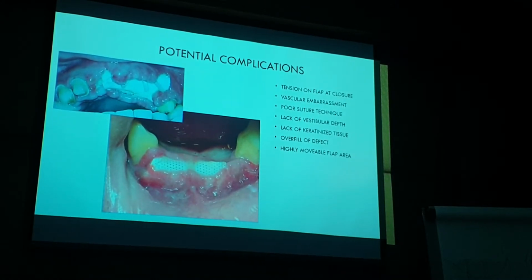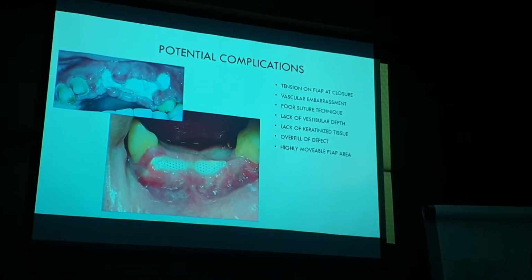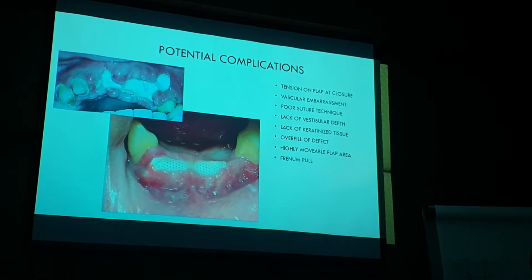But more often than not, you'll find in some of my videos, I don't have enough time to show you everything that we have. It would take literally days for me to go through this. But if I'm going to do a critical area, either bone graft or an implant placement, and I find that there's insufficient keratinized tissue or insufficient vestibular depth, I will do the free gingival graft and the vestibuloplasty first. It only takes 6 to 8 weeks to heal. Then go back in and have fun. And your success rates go up dramatically when you do that. You try it the other way around, you're not going to have that degree of success.